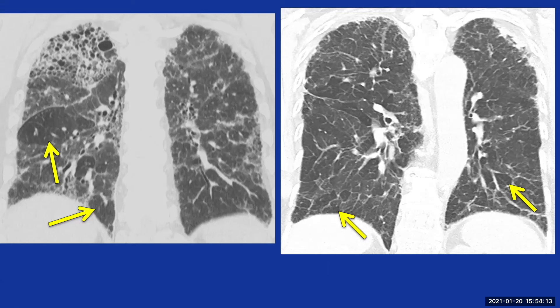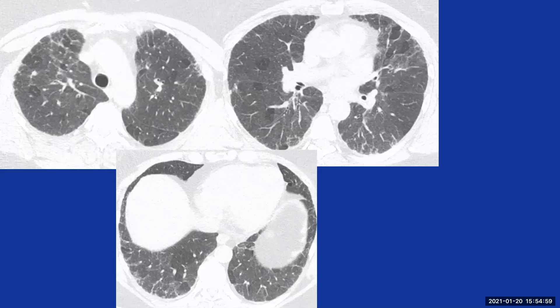Two different patients: on the left, fibrosis is upper and mid-lung preponderant with at least relative basal sparing, and there's superimposed mosaic attenuation — small airway disease with typical fibrotic distribution, a typical fibrotic HP pattern. On the right, the patient has a more diffuse (zonally random) pattern of pulmonary fibrosis. Looking at the lung bases and mid-lungs, there's prominent mosaic attenuation highly likely to represent air trapping — that combination is typical of fibrotic HP.